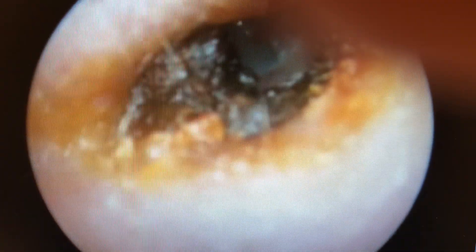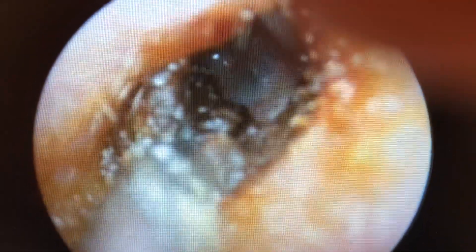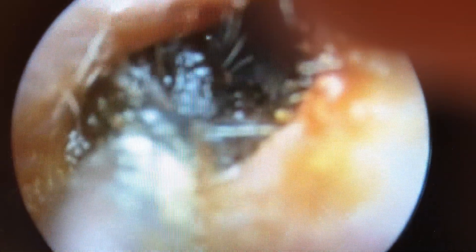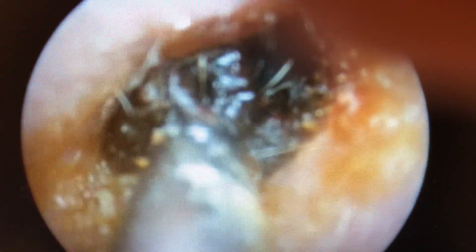Here you can start to see the eardrum as the wax is removed. We're using a number 7 suction to remove the wax. We're able to do this in a painless manner.